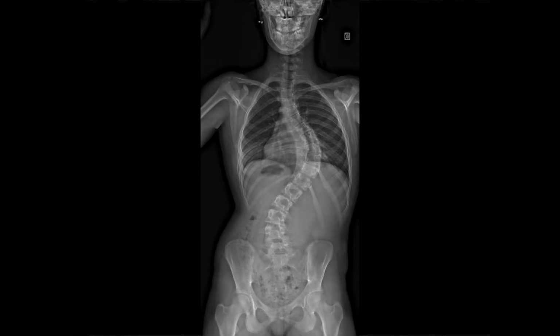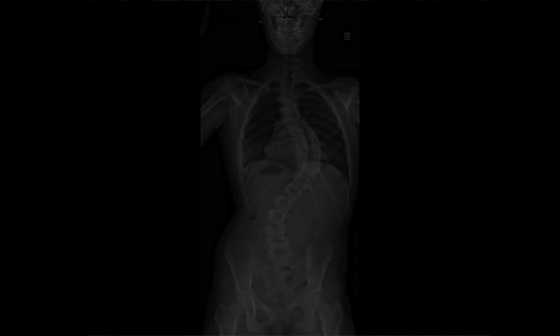And of course, you can do this only by doing repeated radiographs to measure the curvature and to set up the appropriate treatment. Therefore, you need to have repeated X-ray every 4 or 6 months. But really, in the adolescents, it will be every 4 months, frontal and lateral view. So you can see the burden. So moving for repeated monitoring with a very precise method, and since we have very good angle measures and low dose, would allow us to have better follow-up.